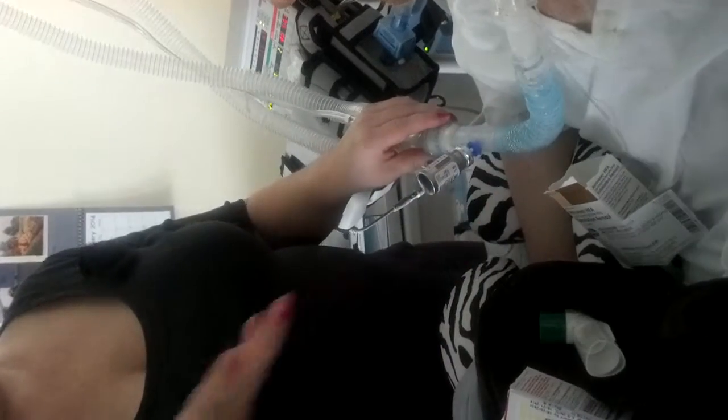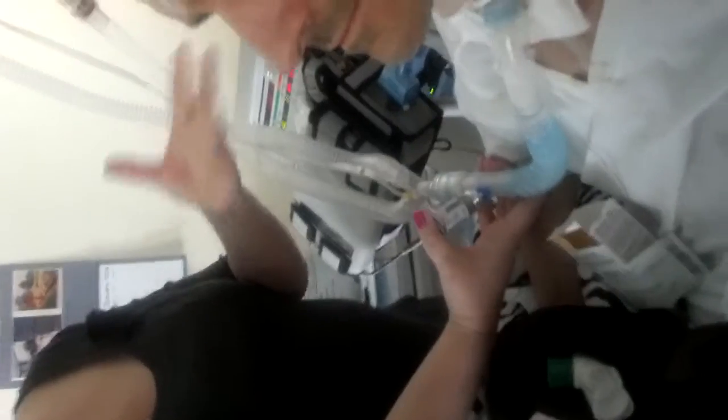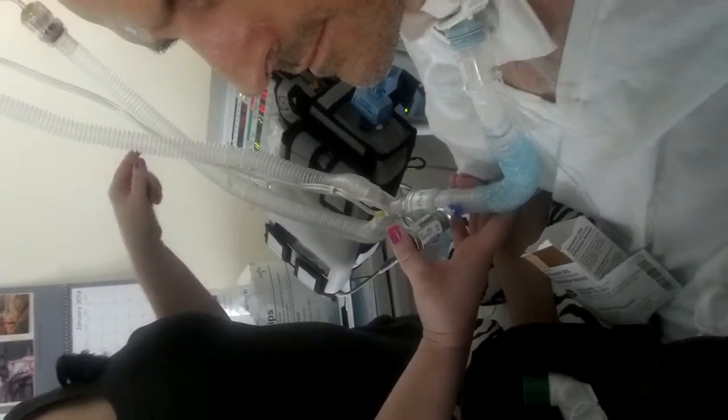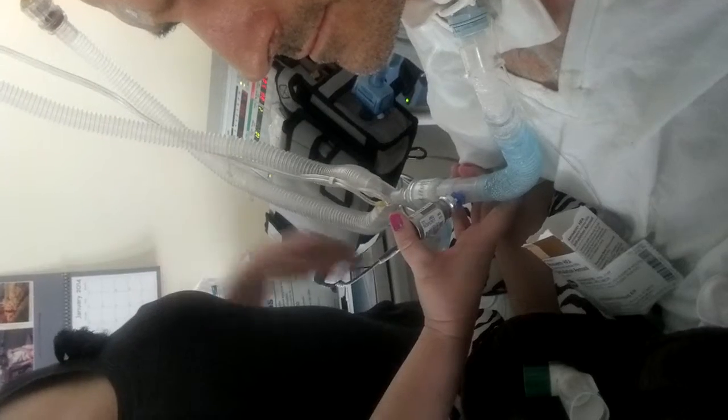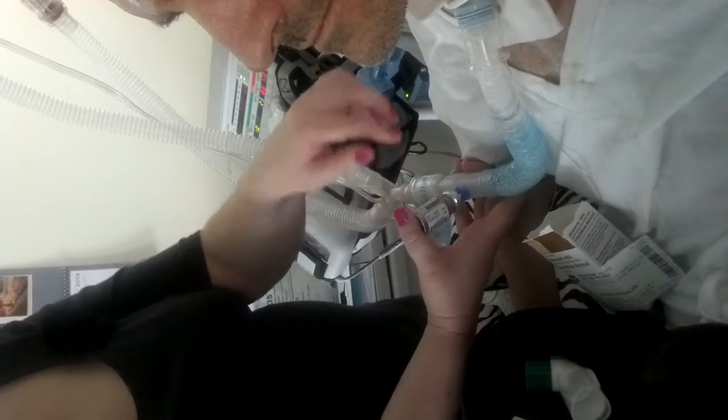I do it by sound, mostly. I'm cradling it with four fingers underneath, the thumb on the top, and I'm bringing my fingers together — that's how it's going to compress it. So, down, in. And I'm going to wait a few breaths. Obviously, I'm going to be doing trach care in a minute.